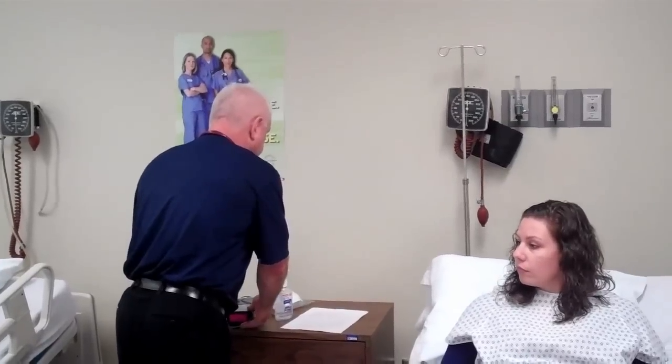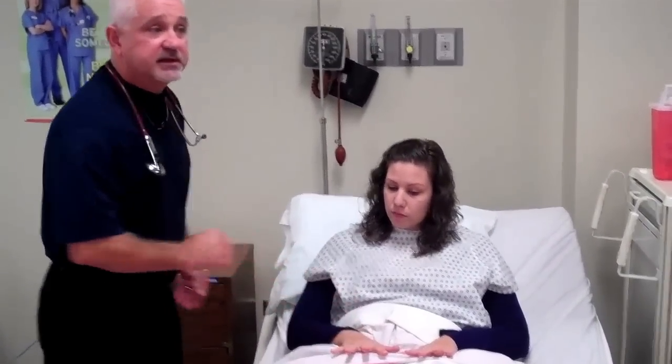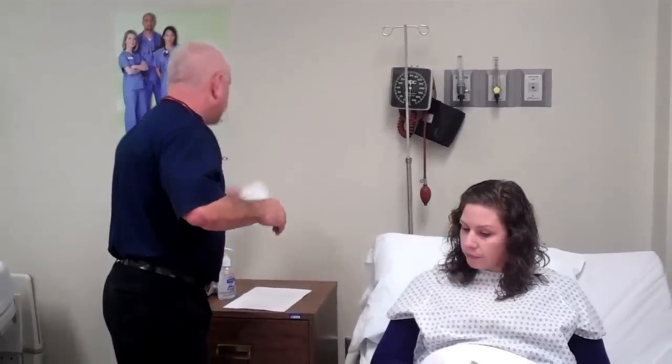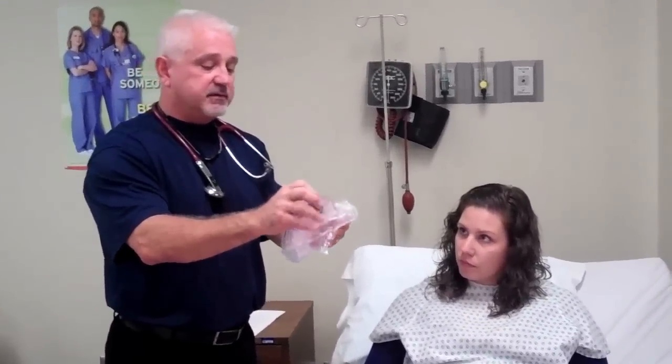Her saturation right now is 90%, and we'd want to be between 95% to 100%, so 90% is a little low. Looking at her nail beds, there's a little bluish discoloration showing some cyanosis, no real nasal flaring, but there is a little accessory muscle use. After finishing the physical assessment, I'd set up my equipment — she's been ordered a simple mask, an O2 mask, which is the first of the reservoir masks.